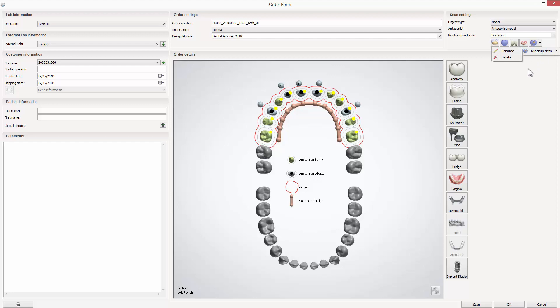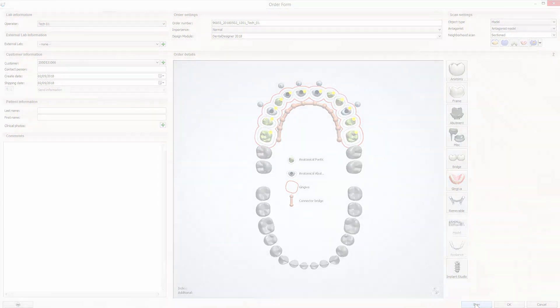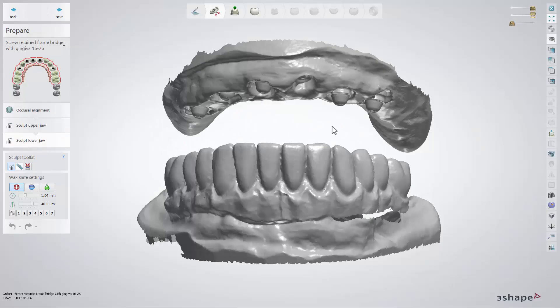Now proceed with the order in the usual way. While in Dental Designer, the visibility of the additional scans can be modified by using the sliders.